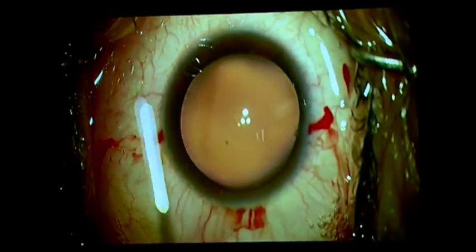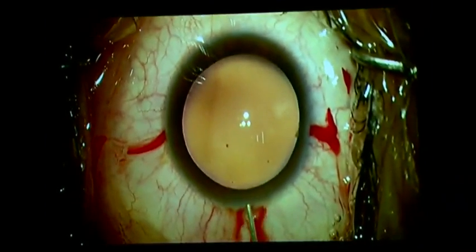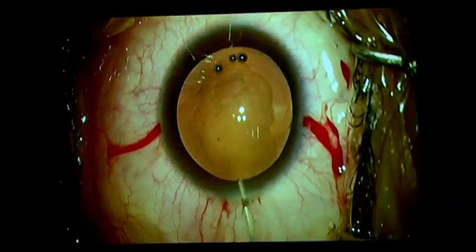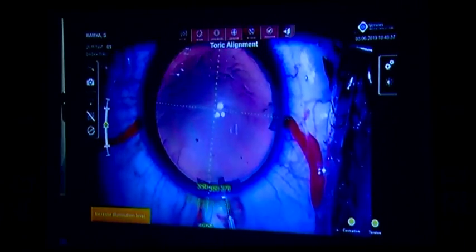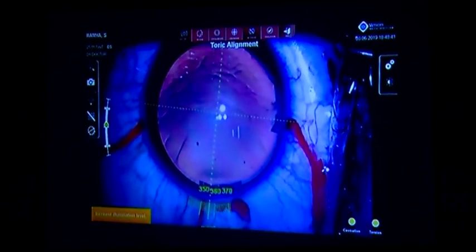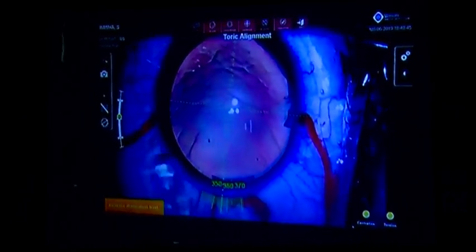Okay. So when I inject my Helon here, you have to make sure you don't go too much inside. Just stay at the edge of the incision. Keep injecting so they don't touch the anterior capsular lens. This is very, very critical. Otherwise, sometimes you have a habit from doing cataract surgery and it goes directly inside and touches the lens capsule.